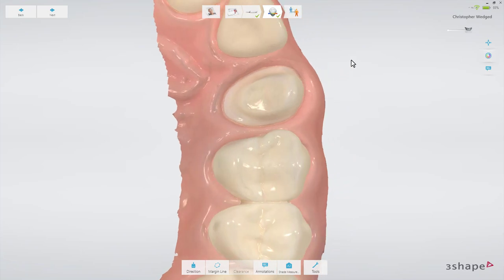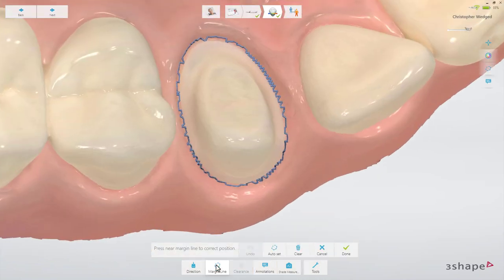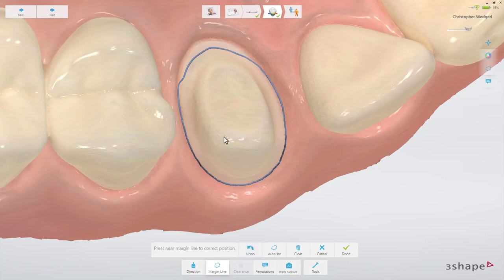Now that the scan has been post-processed, you can place the margin. In order to create a margin line automatically, press the margin line button.